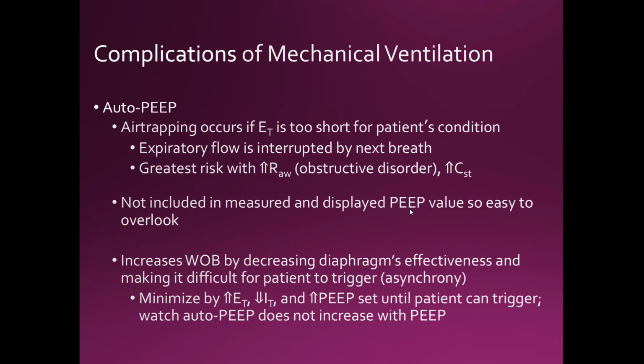All right, so now you have to consider what your baseline PEEP is, and your auto PEEP, and your trigger. You will know that you have to do that when you press your expiratory hold button. That is most likely the only way you can determine if someone is air trapping. I want you guys to remember that. Your expiratory hold button or your expiratory pause button will tell you if the patient is air trapping or not.